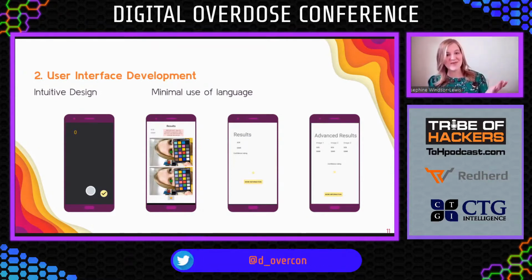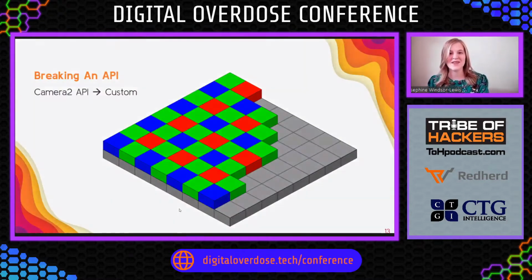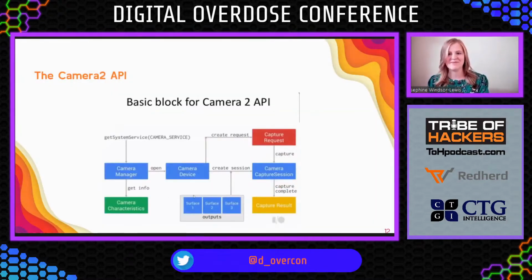So now we've designed it, that's pretty much it. Nope, got to build it. We decided to use an Android interface because you have way more control over the camera. They've got this handy Camera 2 API, which is a fairly recent release. It's an application programming interface. It's basically a framework, a bunch of functions programmers can use to build their own apps.